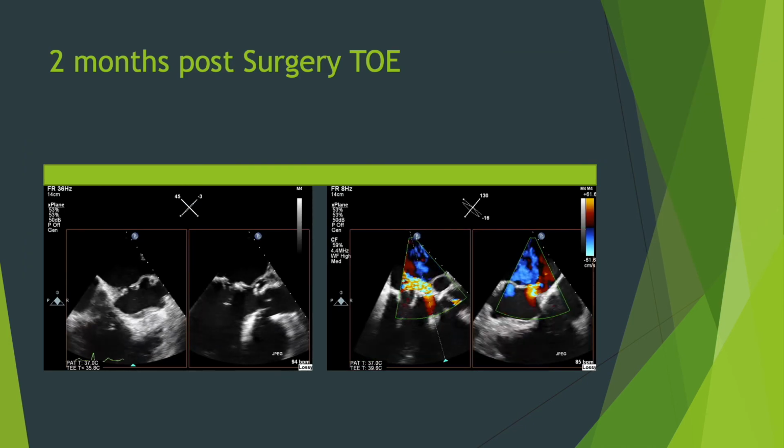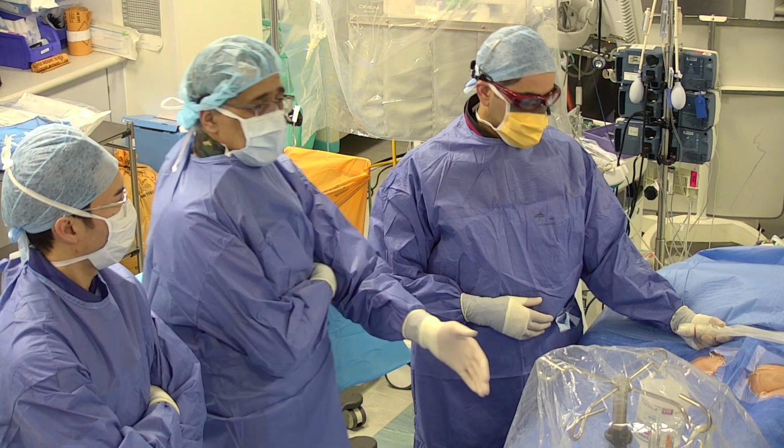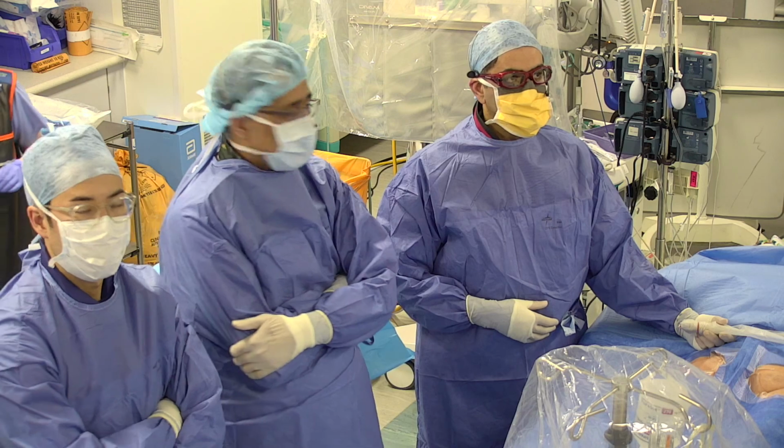So let me introduce the team. Neil Ruparelli is with me, myself, Iqbal Malik, Chris Cook, our fellow, the fantastic Cath Lab team, Bushra Rana on echo. So we've got amazing echo, and Claire Boyd and our anaesthetist who's keeping the patient very stable. So that is the team, and there's a lot to discuss here.